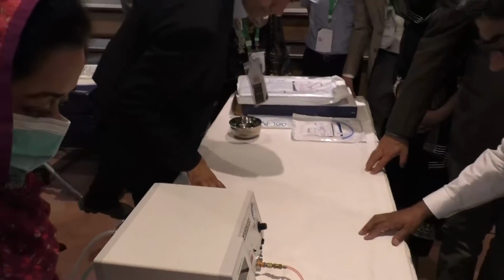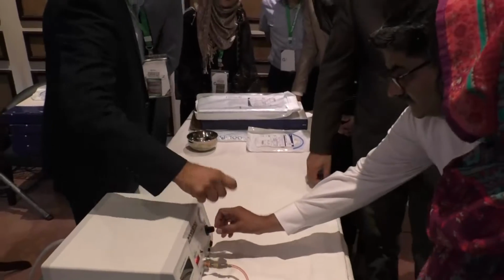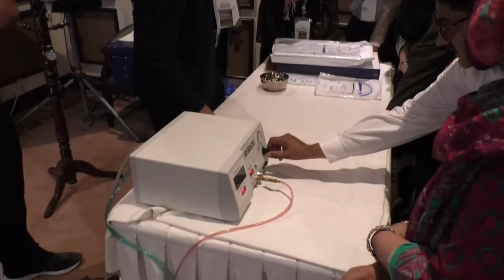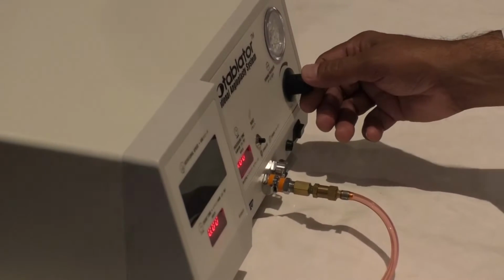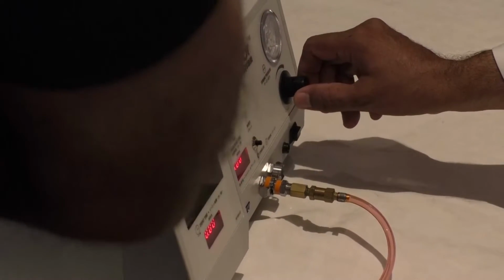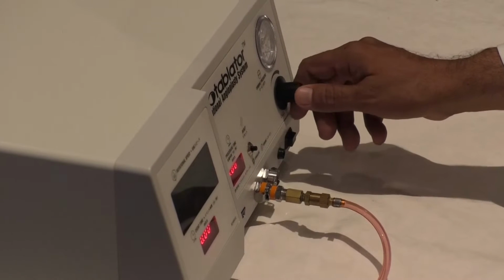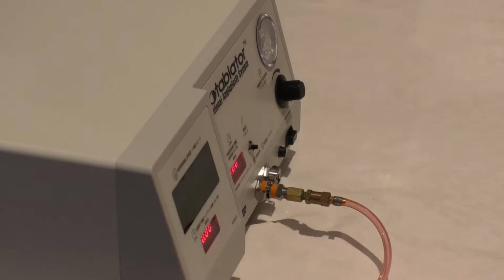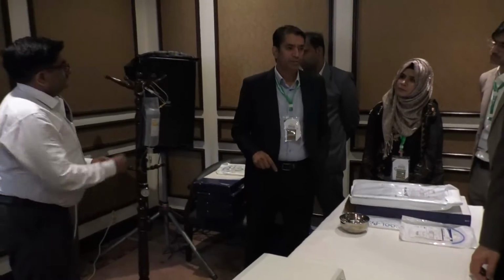Turn this on. Sorry, and this is the knob for RPM selection. It's simple like this. It's something like a knob. Counterclockwise reduces the RPM and clockwise we can increase the RPM. Next, this is the cylinder. Thank you. This is the console, and now this is your solution.